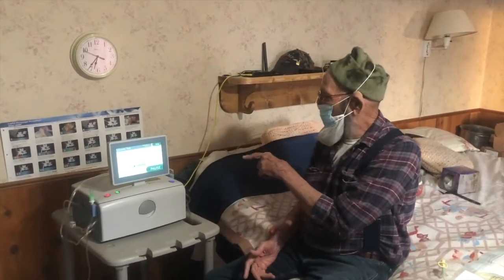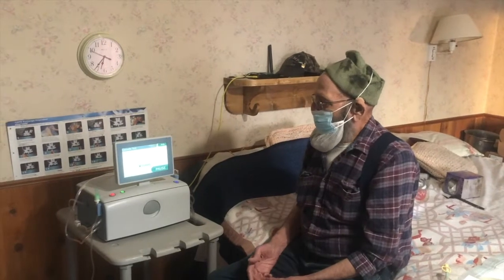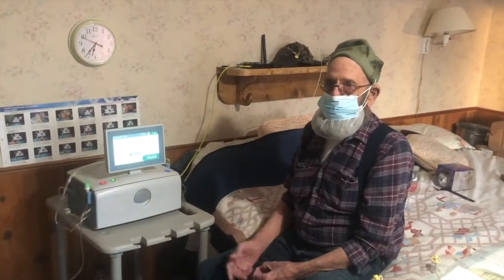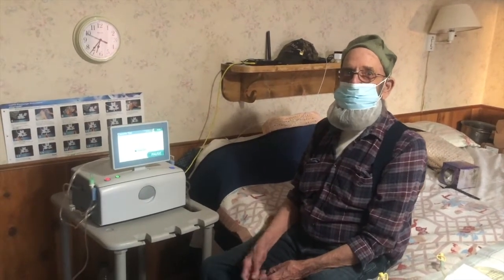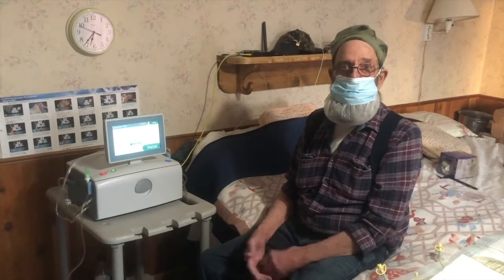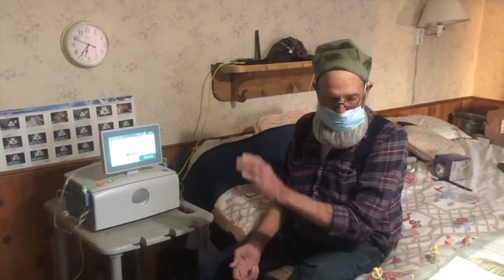Anyway, I put that up there. If you leave it on the floor, that first 25 or 30 cc's that goes in is pretty chilly. But if it's up there, it gets some heat. So that's the reason for that.